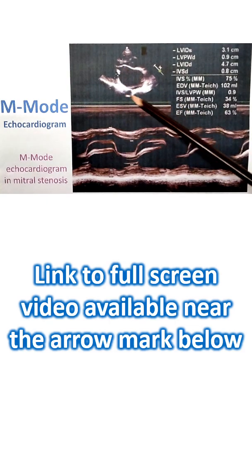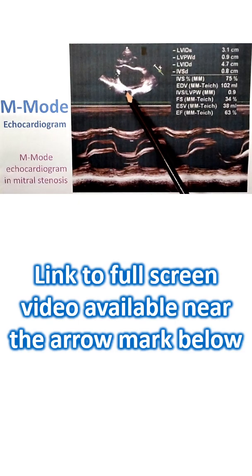This is cross section of descending aorta, and a portion of the coronary sinus is probably seen here. So in M-mode, this is the flattening of the EF slope, thickening of both leaflets.